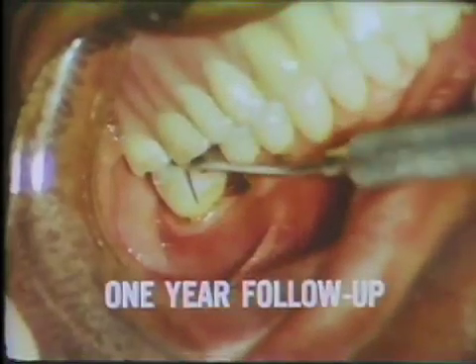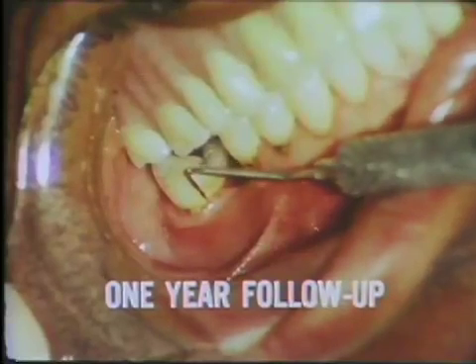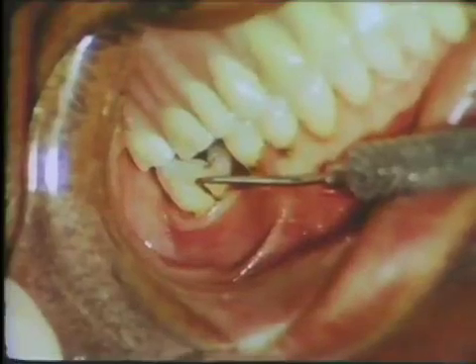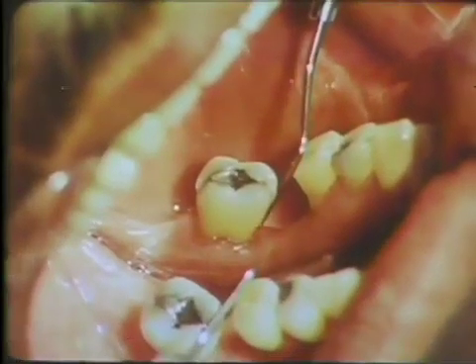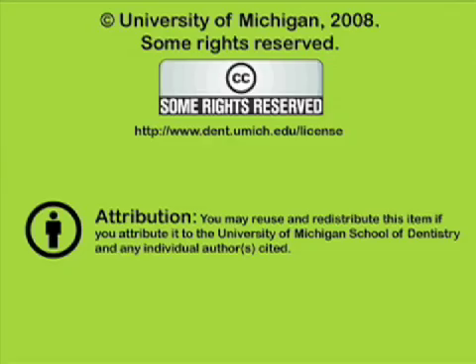One year after surgery, there is adequate attached gingiva on the buccal side of the molar, and the gingival crevice is shallow. The lingual view also demonstrates a satisfactory result. A follow-up radiograph shows complete elimination of the intrabony defect, which had existed previously at the mesial aspect of the tilted molar. The patient is now ready for a fixed prosthesis to replace the missing teeth.